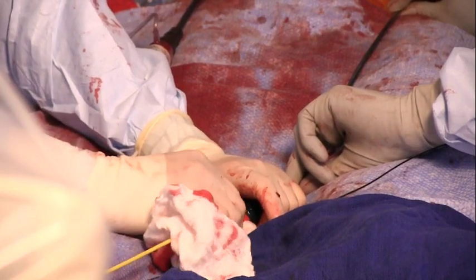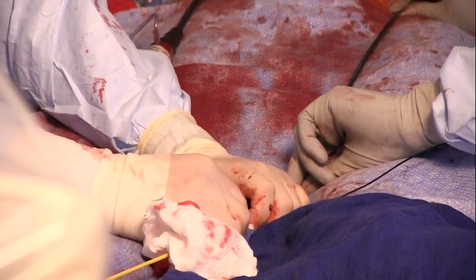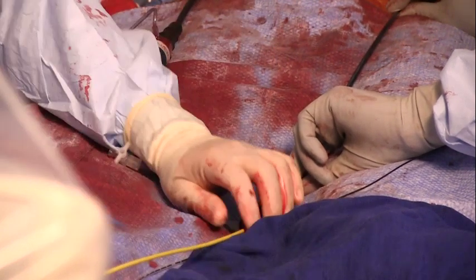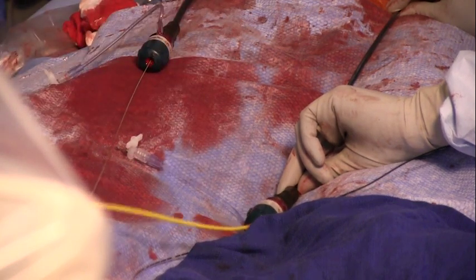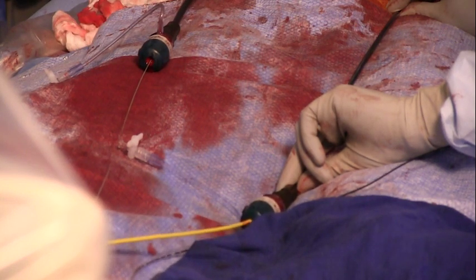After identifying and treating any complications, use the power injector to perform a completion aortogram. Confirm the patency of the aortic branches, especially the renal and hypogastric arteries. The post-treatment angiogram is also used to identify any signs of endoleak, which cannot be detected with IVUS alone.